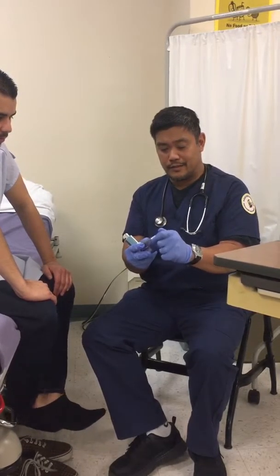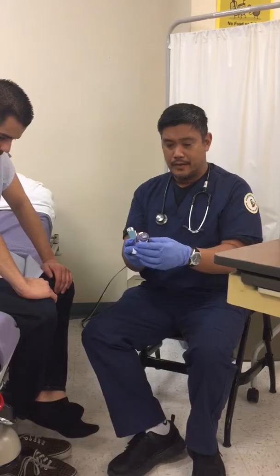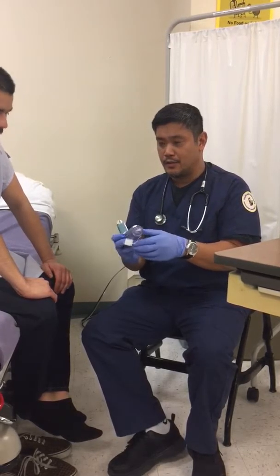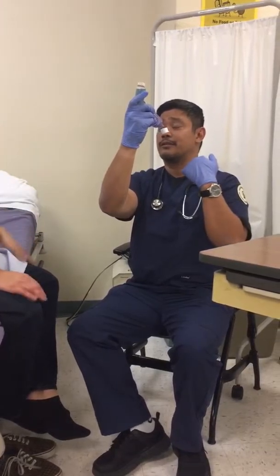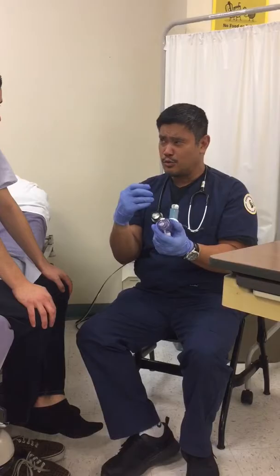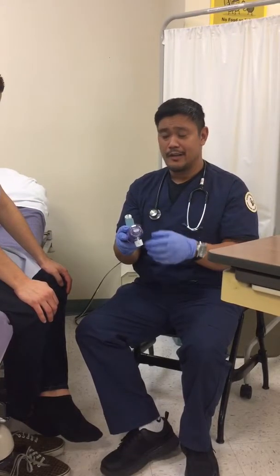Just remove the cover for your mouthpiece. Take a deep breath, exhale out, wrap your mouth around the port here, and go ahead and take a slow, deep breath. If you can tilt your head up a little bit, it'll allow the medication to get to your lungs easier. If you do take a breath too quickly, there is a whistle right over here, and it'll tell you you're breathing in a little too quickly, and you're going to want to slow down a little bit.